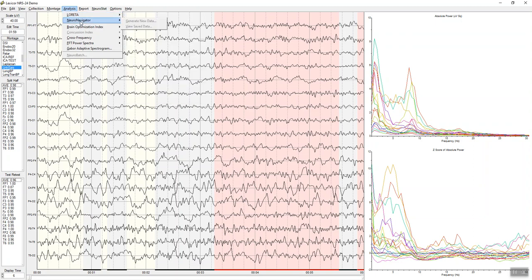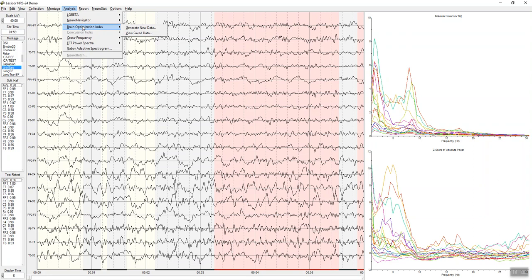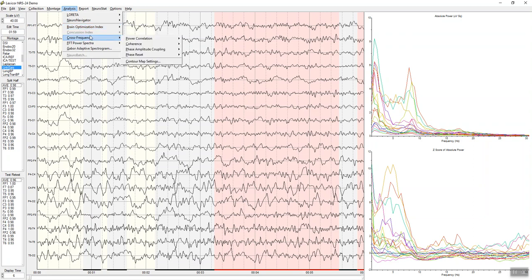You can also activate the Neuronavigator. Brain Optimization Index is a tool to allow you to compare an individual to a peak performer. We took individuals that had 120 IQ and higher as a reference, and you can compare the distance different networks have in the brain: the attention network, the default network, the pain network, the memory network, etc., with respect to this peak performer group. You can move people in the direction of greater efficiency in the brain.